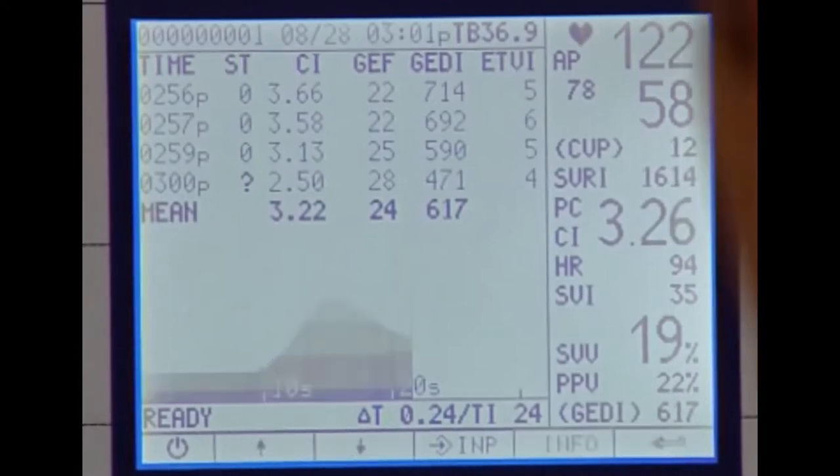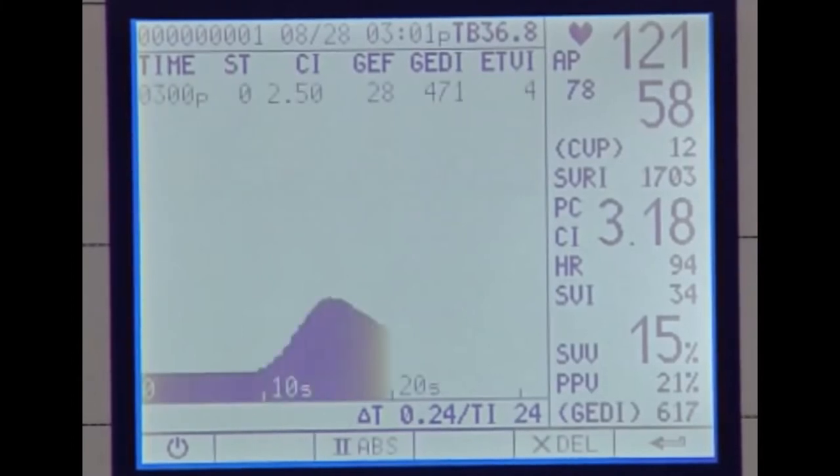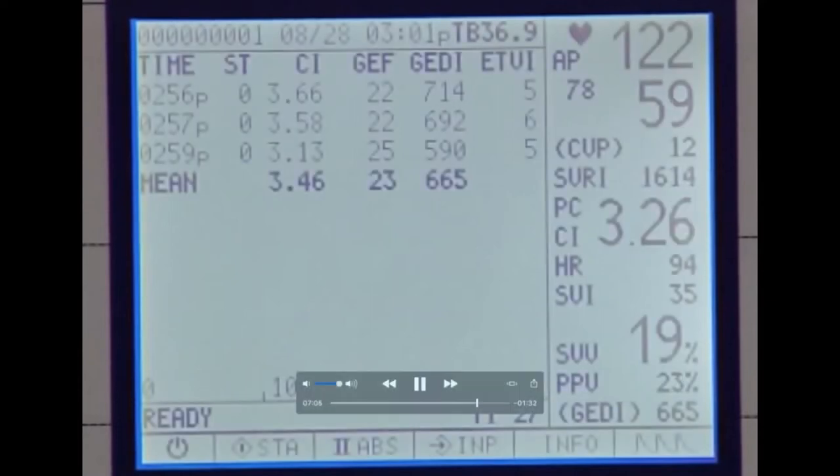By means of the info button on the thermodilution screen, you have the possibility to delete measurements with the delete key, and you can see details of previous measurements. Alright, so this is a little different monitor, but the basics are the same. So that is the way you inject the cold saline.